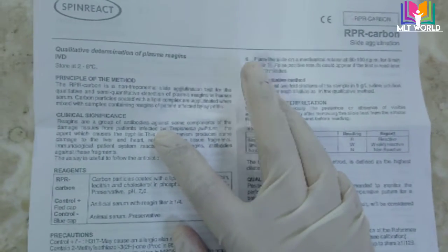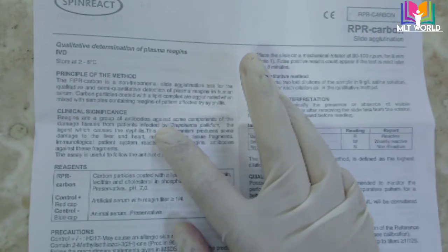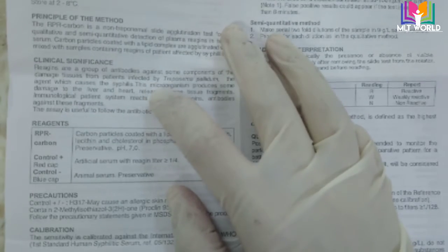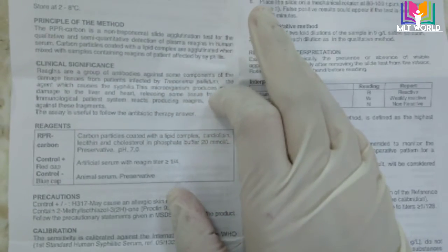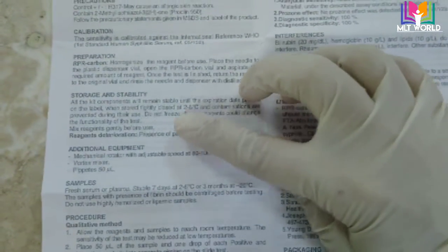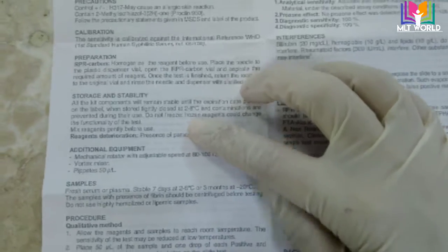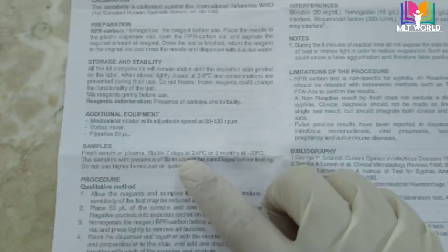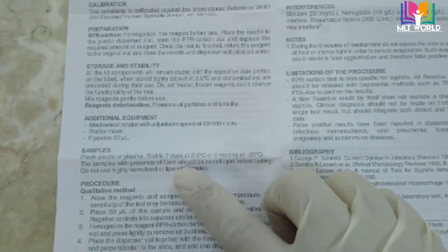Whenever a new kit arrives, first check the literature — the insert that comes with the kit. Note the important points. First, check the principle of the test: how this test is performed, whether it is an antigen-antibody reaction or whatever the principle is. Study the principle of the test thoroughly.